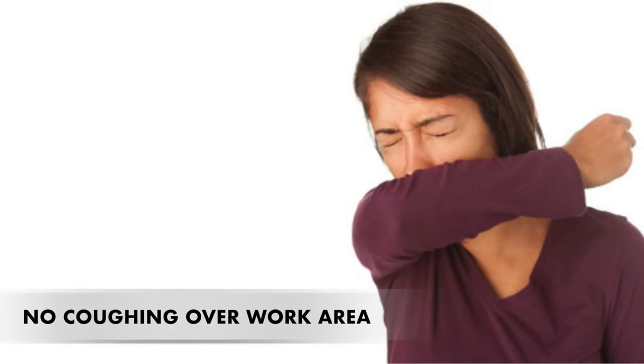Another way to keep things clean is if you need to cough when you're handling your IV and supplies, turn your head to the side and cough into your arm. This keeps germs away from your IV and supplies. If you have a cough and you have a mask, you can put your mask on to keep your germs away from the area that you're working on.